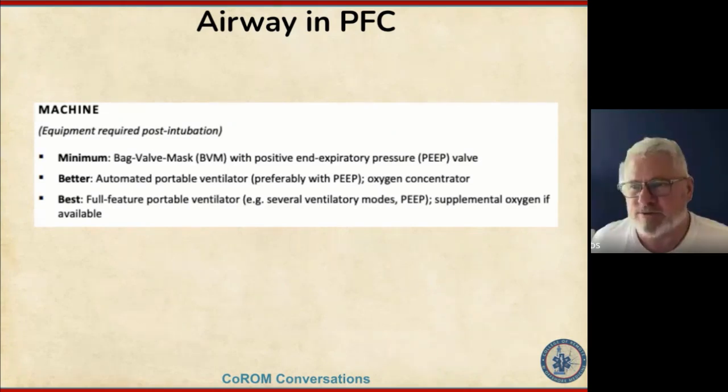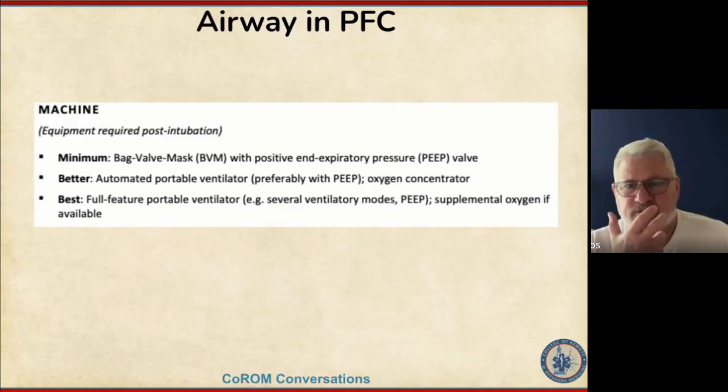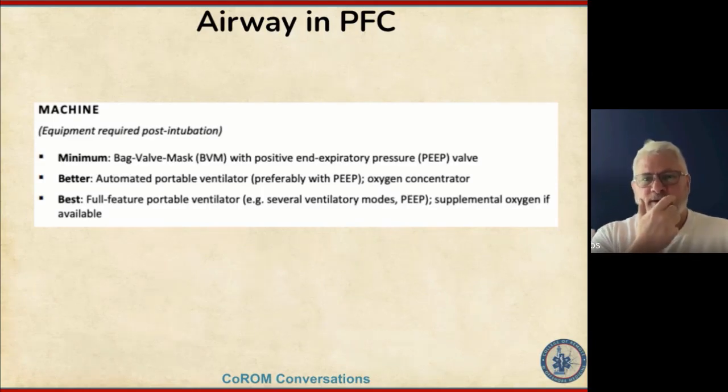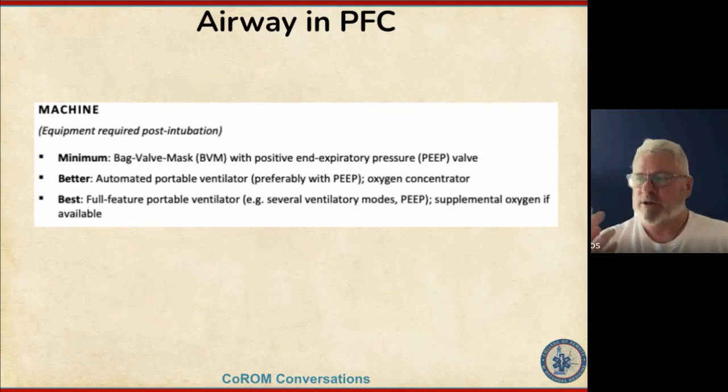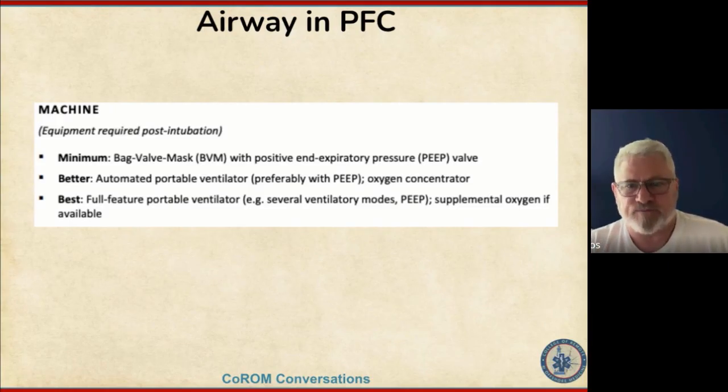I would just modify that to simplify it. I would take a BVM and a PEEP valve and just put it on your face. Set the PEEP to 5 and just breathe. You should be able to expel the air just by relaxing and exhaling. And then crank it up to 10, maintain a good seal, and you might have a little bit more resistance just exhaling, normal exhaling. When you get to 15 or 20, you're going to actually have to force air out, in a normal, otherwise healthy person, when you have a proper seal and you have the proper PEEP set and you maintain that seal.